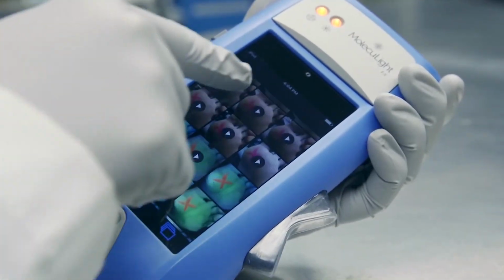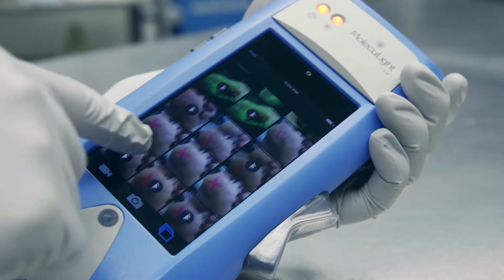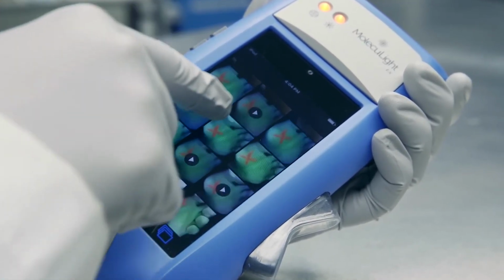Once the photo is taken, the AI analyzes it. It uses computer vision, so basically it's been trained on thousands of wound images to recognize patterns. It identifies the wound edges, and it breaks down the image into tissue types, red, yellow, black, pink. It measures dimensions as well, so it calculates the area and the volume, and all of this happens in seconds.